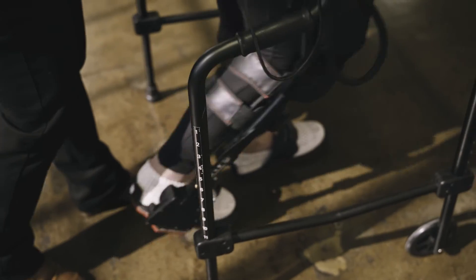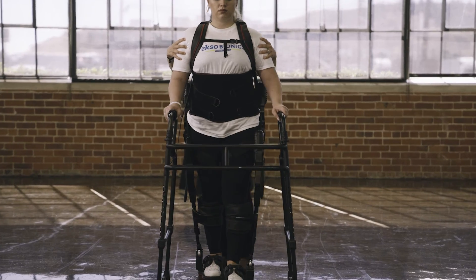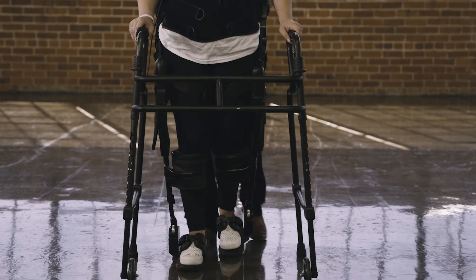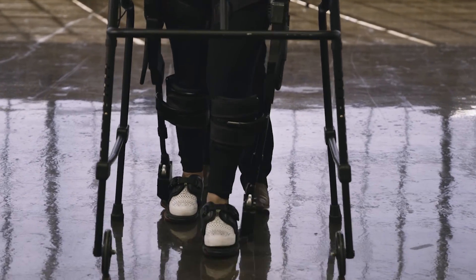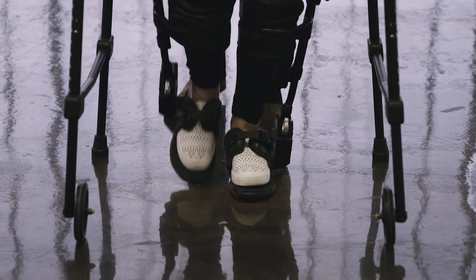In Free Gait mode, the patient has the freedom to practice walking faster and show the PT what they have learned, while still being appropriately supported at the hip and knee with stance support and maintained in the sagittal plane. Free Gait allows for error learning and acts as a bridge to move to more efficient overground ambulation without EXO.